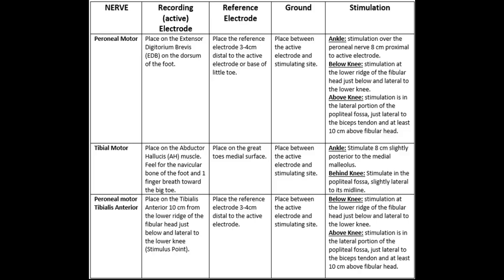So be careful about that. It has to be below the fibular head and lateral part of the lower knee. Above the knee, in the popliteal fossa, if you go a little bit lateral, that would be helpful. But again, that comes with a little bit of experience. Doing it in the fossa is harder. You have to bend the knee as well to get it deeper in the popliteal fossa.